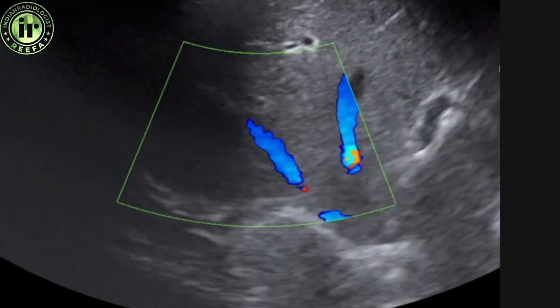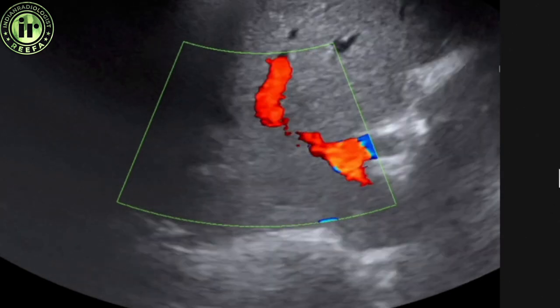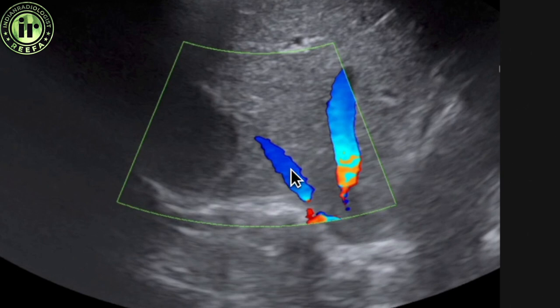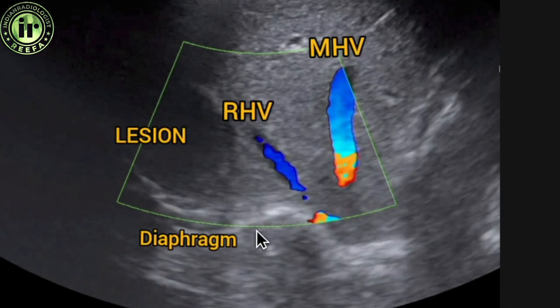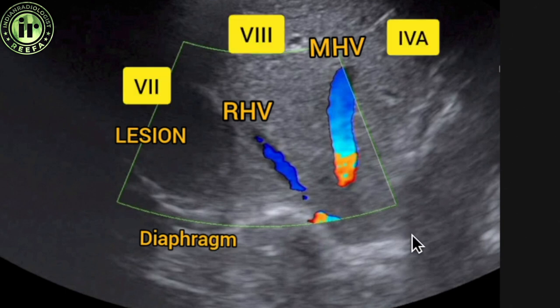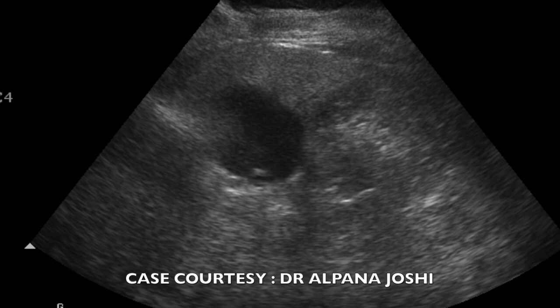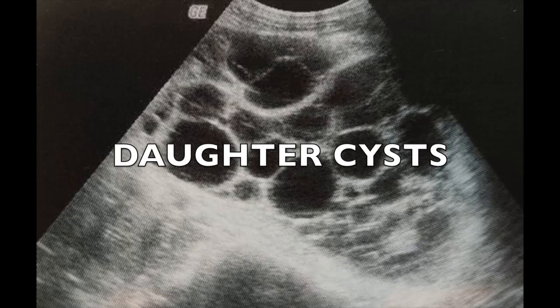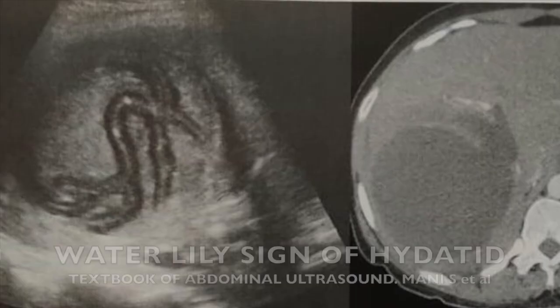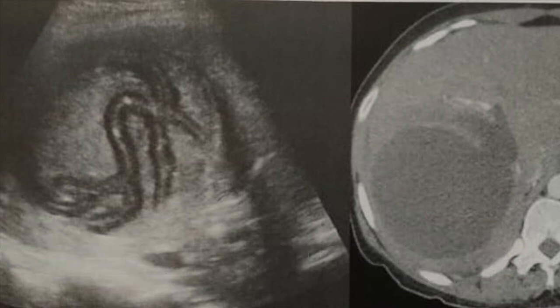Another case: asymptomatic patient on routine checkup. Hepatic veins (right and middle) are identified. A lesion adjacent to the right hepatic vein just below the diaphragm, with slight rim calcification, appeared to be an old infective lesion — middle hepatic, right hepatic, diaphragm — in segment 7. It turned out to be an old hydatid cyst. The patient had a history of hydatid infection 15-20 years prior with a unilocular cyst, and records were preserved. Hydatid cysts can present in various forms: unilocular, with daughter cysts, ruptured (sometimes into the lung), or with a water lily sign due to collapse of the endocyst membrane.